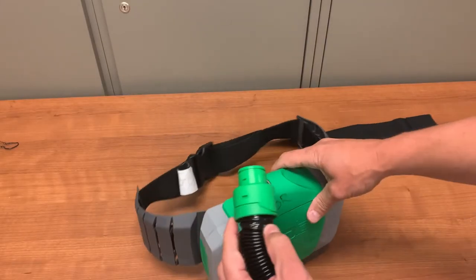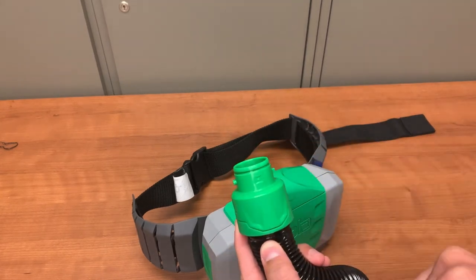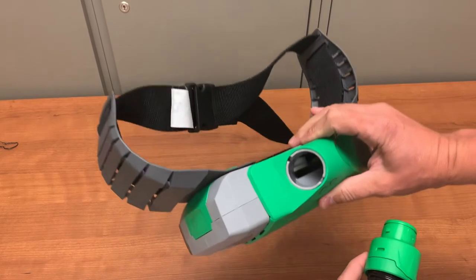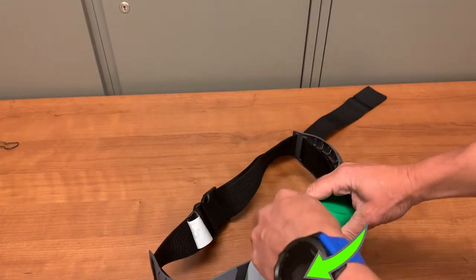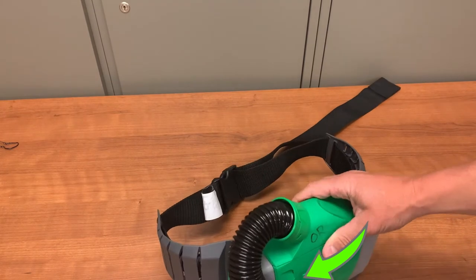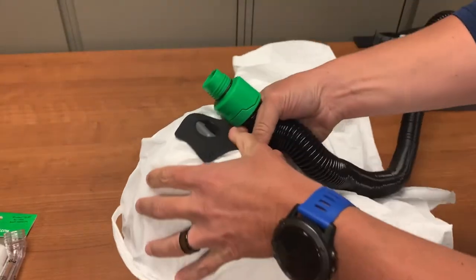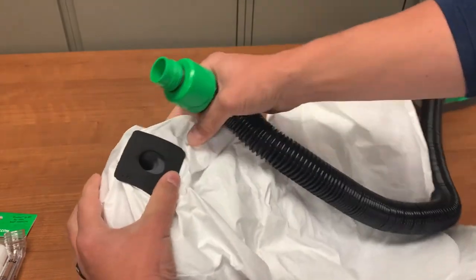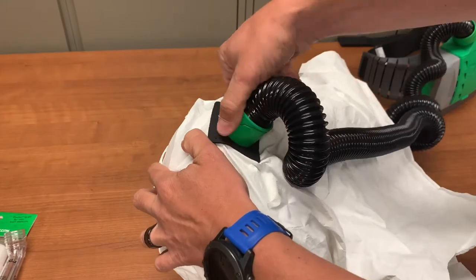To attach the hose to the PAPR, take the end that has two plastic nubs on opposite sides of the hose — they will match with two slots in the PAPR's port. Insert the hose into the port and twist it clockwise to lock it in place. To attach the hose to the hood, take the threaded end of the hose, locate the opening on the back of the hood, and screw the hose into the hood until you meet resistance.